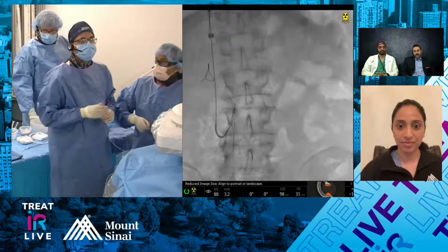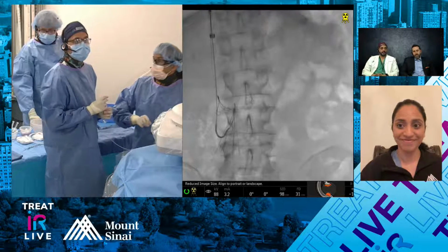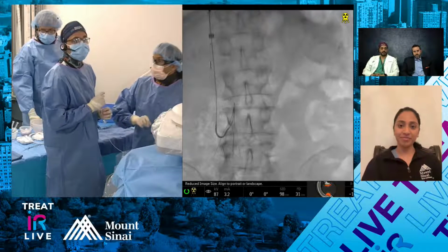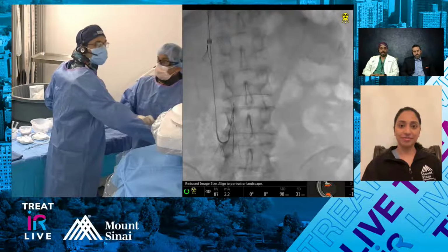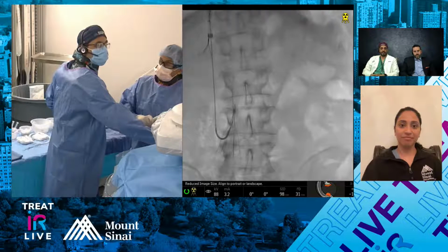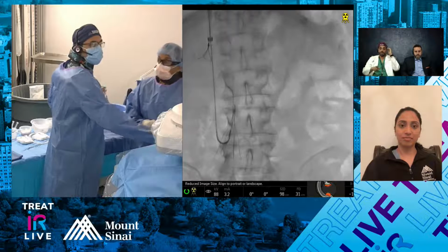And that accommodates that. And like I said, I'm pretty quick to forceps. Yeah, same here. I'm fairly quick to go to forceps just because ultimately I don't find the hangman works all the time, or sometimes I end up getting the wrong part of the filter and it ends up making a bigger mess. So I have a low threshold to go to the forceps for these types of filters.